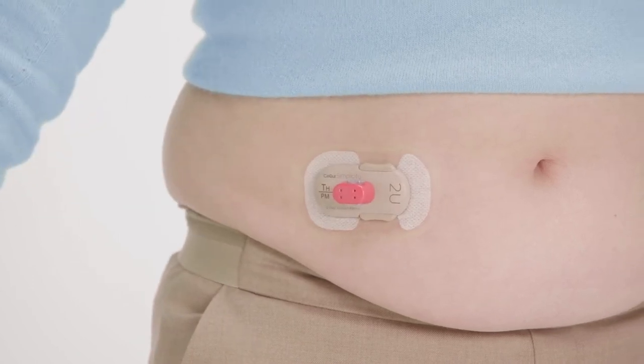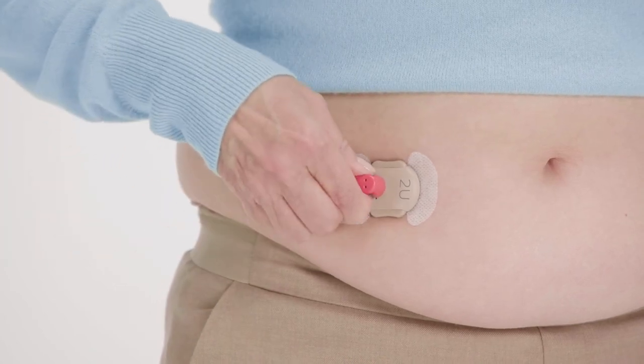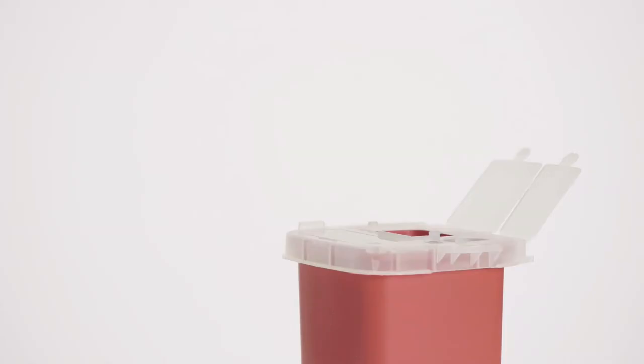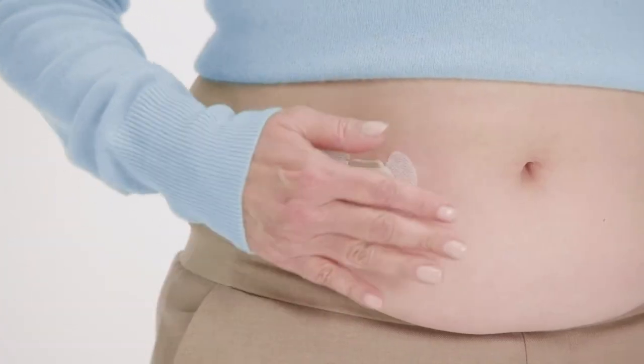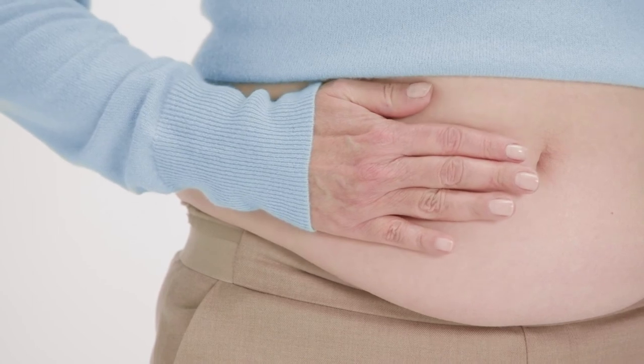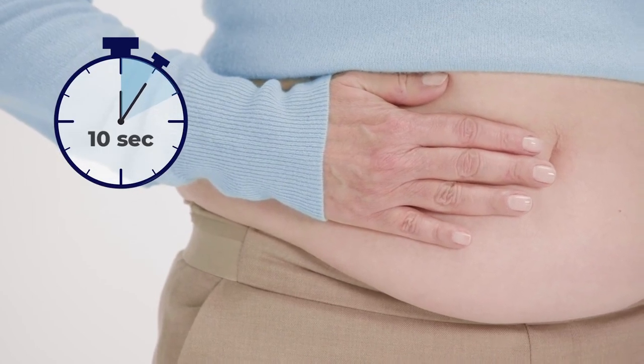The inserter is reusable, so put it in a safe place to be used for future patch applications. To remove the needle, squeeze the clear sides of the red cap and pull it straight out. The cannula stays in your skin. Put the red cap in a sharps container and throw away according to local guidelines. Press down firmly on the patch with the palm of your hand for 10 seconds to secure it to your body.